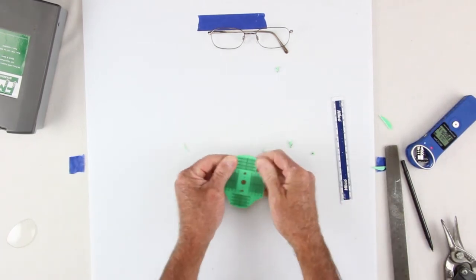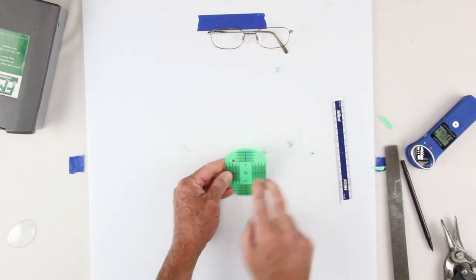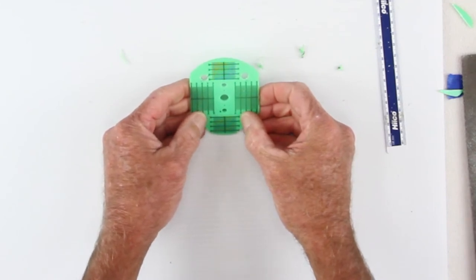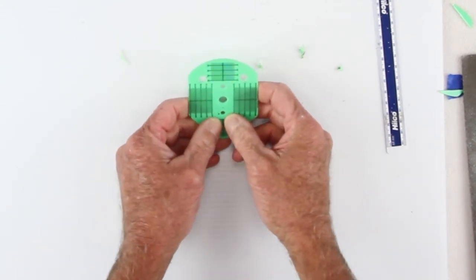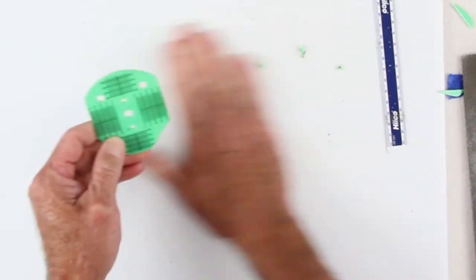All right, so hopefully you can kind of see where I'm going with this. We've got our chin down here, we've got our two eyes, and somehow we're gonna have to make a little face, little smile kind of thing down here. I'm gonna have to wait on that, I think. I'm gonna have to do that on the lens. I don't wanna mess this up because I'm gonna need this to hold it in the edger.